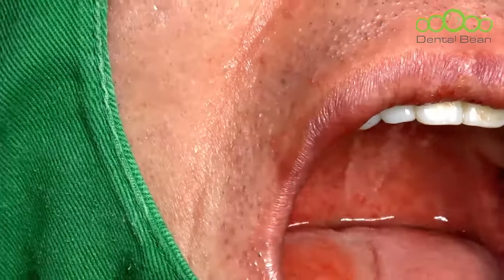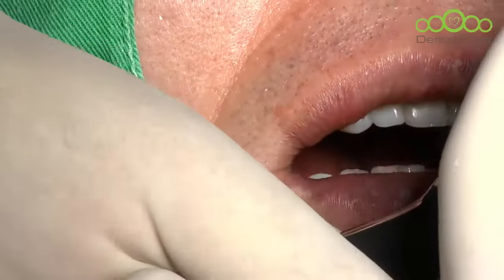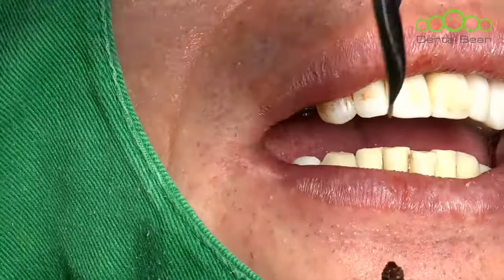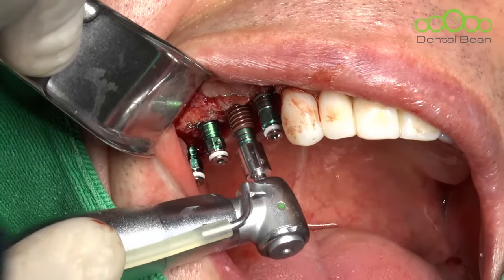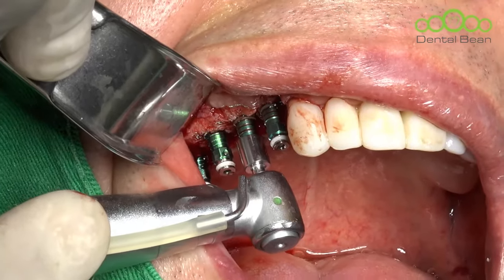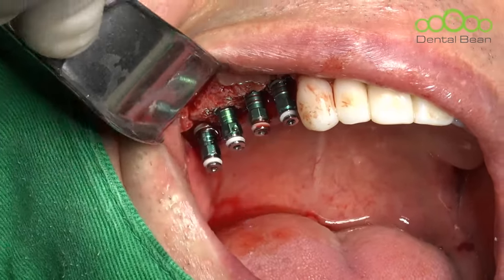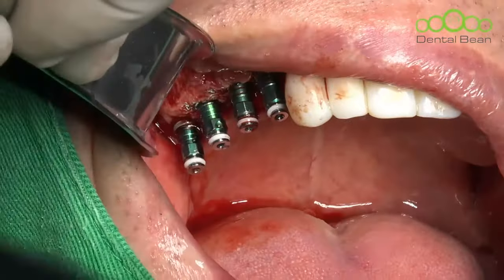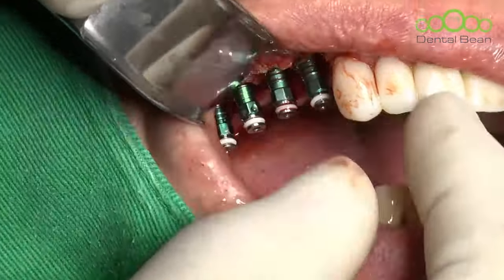Okay. Yeah, 4x10 implant. Well, even if I change the position, I don't worry about the implant stability. If it became weak, just a mess, no problem. Well, slight. Okay, no problem. Close, please. Okay, good. Then let's remove the mount.